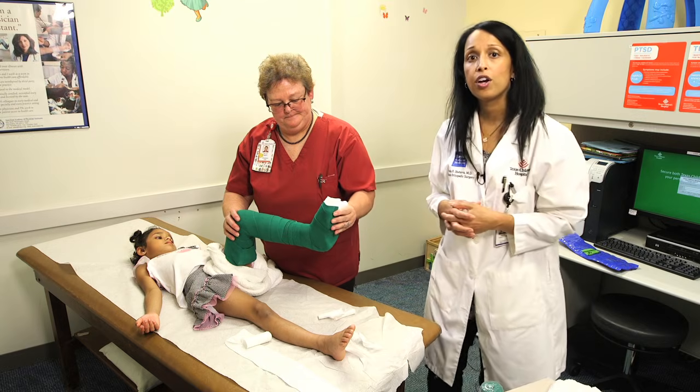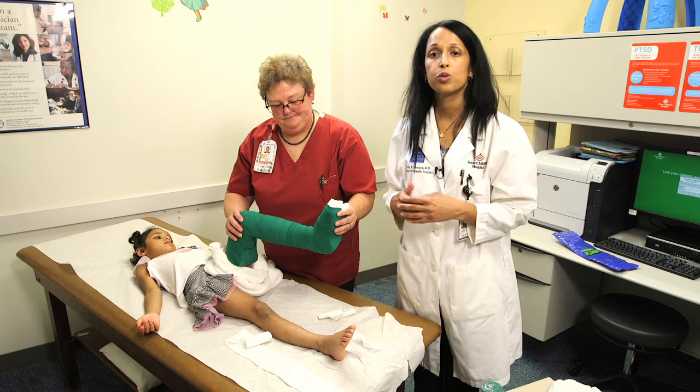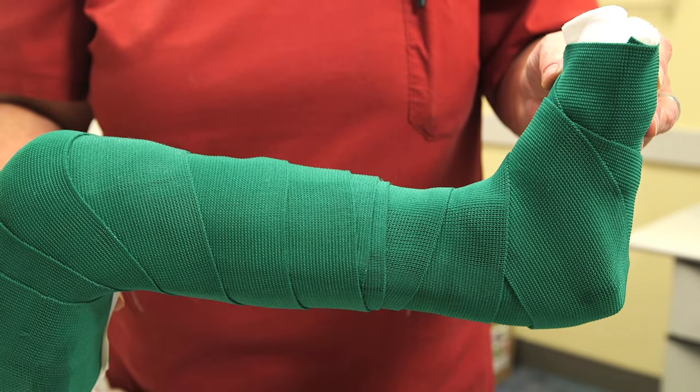And you want to wait for that to harden. It typically takes about 5 minutes or so, so you want to hold the patient still during that time period so you don't develop any wrinkles or creases while the fiberglass sets up.